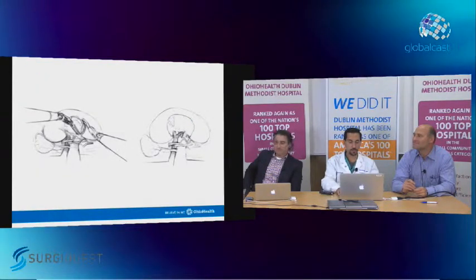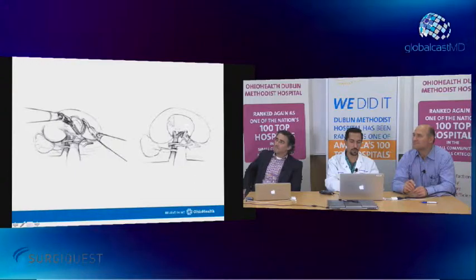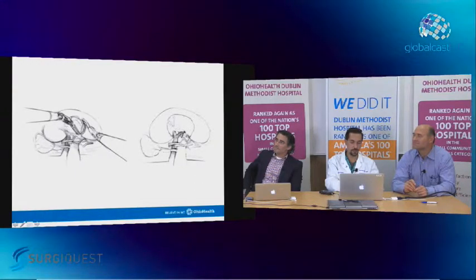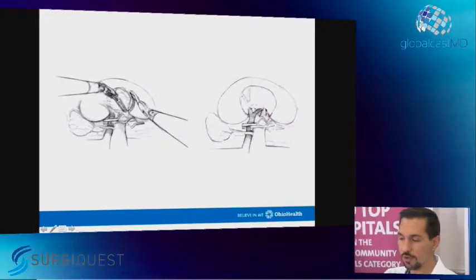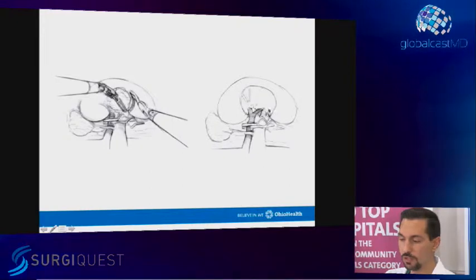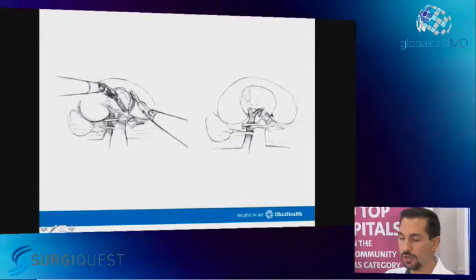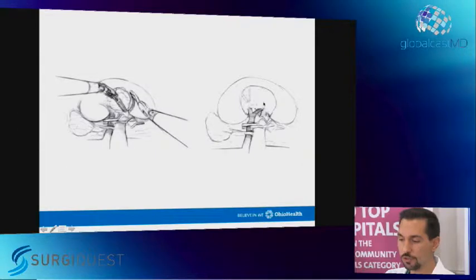So this is just a picture from a paper that Kauk published about how to tackle these hilar tumors. But essentially, the picture that I liked here that he made was that once you're done resecting the hilar tumor, you end up with this kind of horseshoe defect. And again, you've got these big vessels coming in here. The hilar vessels are coming in the defect. So you have to be careful not to knock these off. So you don't want to have any sutures going across in this direction. Otherwise, you're basically ligating the vessels, and you'll lose a large portion of kidney. So the key is just to stay shallow and have your stitches go parallel to the vessels all the way around. And then again, you don't want to have any sutures going in this direction that might knock off any vessels deep in the kidney.